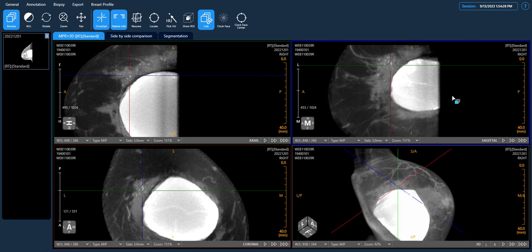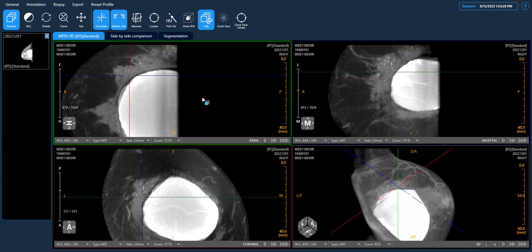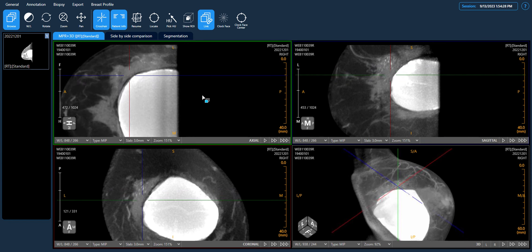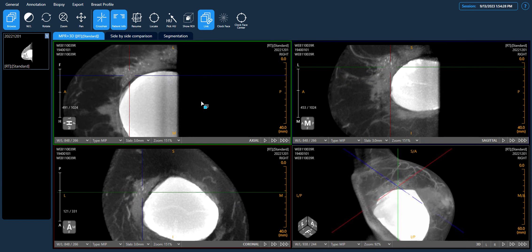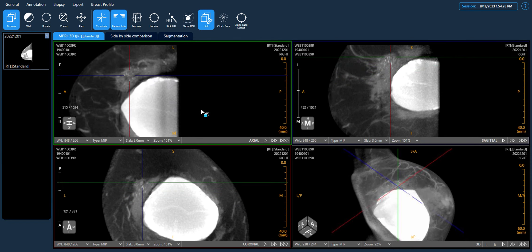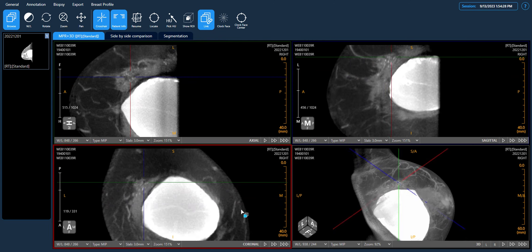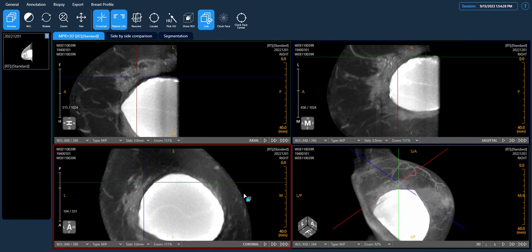In breast CT, the implant does not disrupt the visibility of microcalcifications. We can co-register the suspicious area and examine the same location in other views to obtain more details.